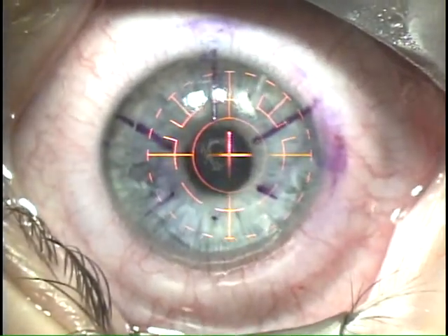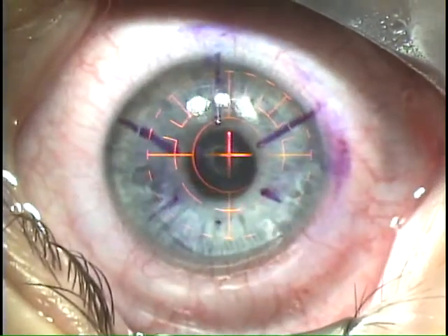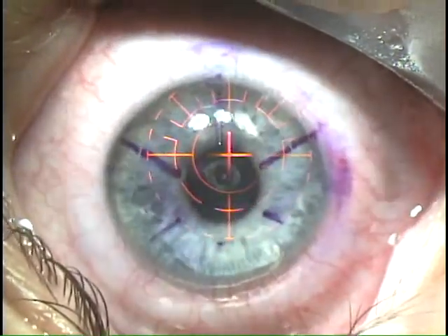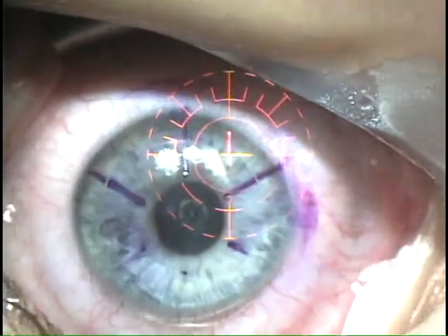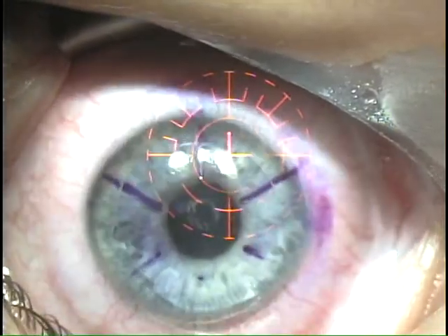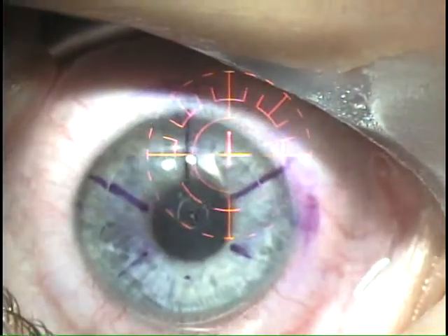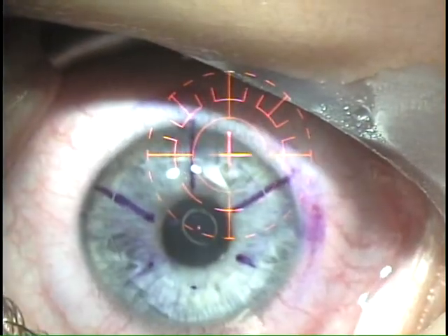Let's do a little interview with Ben. So Ben, what are your thoughts about having the laser? About having the laser? What do you mean? How did it go for you? It went real well. I thought you did a great job. What would you say to patients who are worried about doing this? I can't even feel a thing, you know. I thought you were an excellent patient. You should have a great result and we're very pleased. All right, thank you very much.